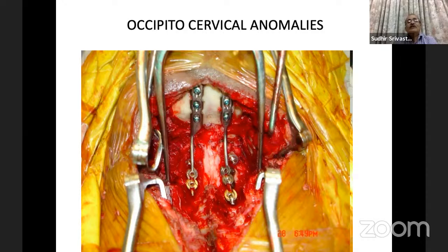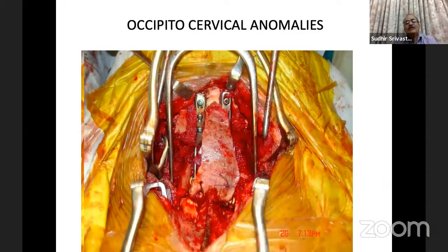And then I have again put this long graft, where I have stabilized the graft by actually tying it. So this is very essential in the occipitocervical area. You must have a bridging graft, and you must give stability to this graft, though you have stabilized the area.